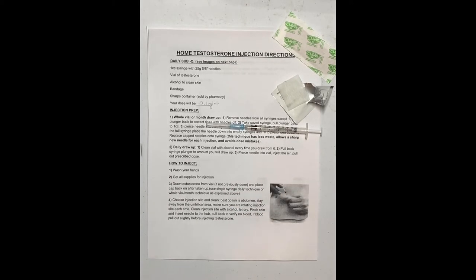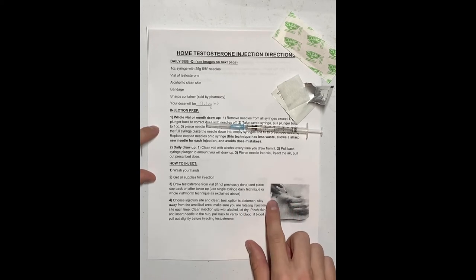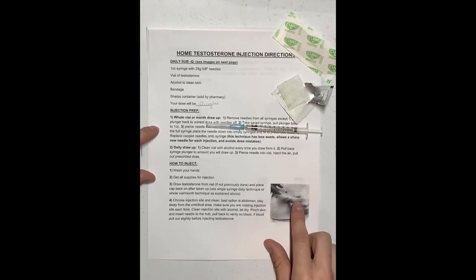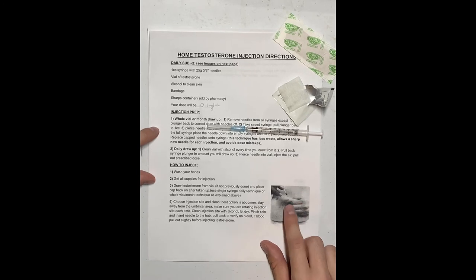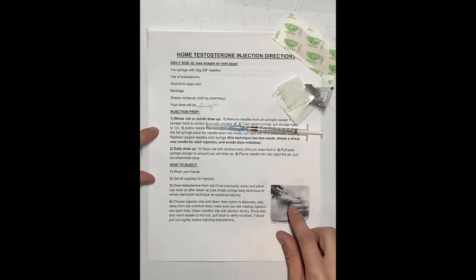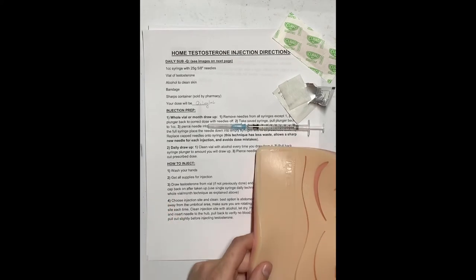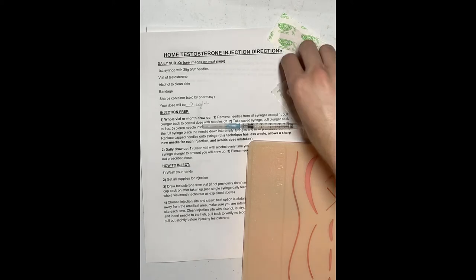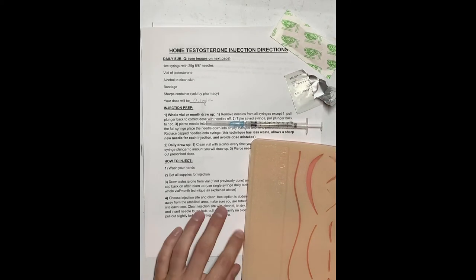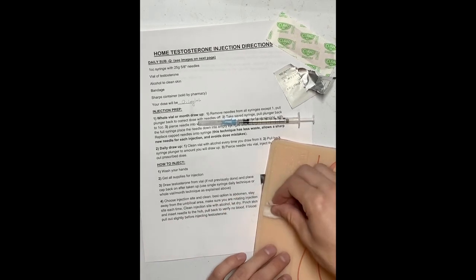Choose your injection site. The best option is the abdomen — you want to go lateral, or outside, of the belly button. Make sure you are rotating your injection site; don't inject in the same spot twice in a row. Go across the belly button or to a different spot each time. Here is my mock belly — just to the outside of the belly button — and I'm going to go ahead and clean my skin.